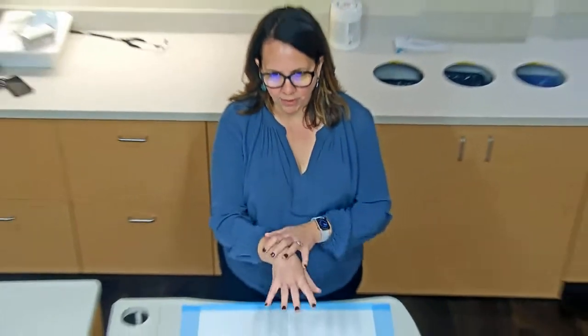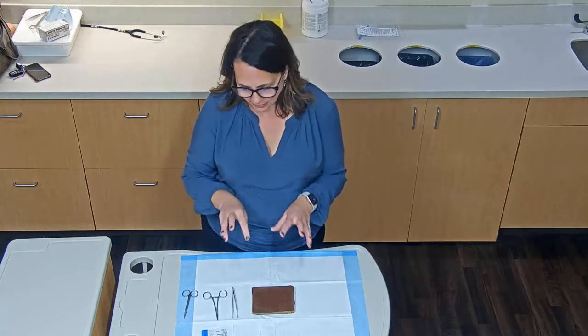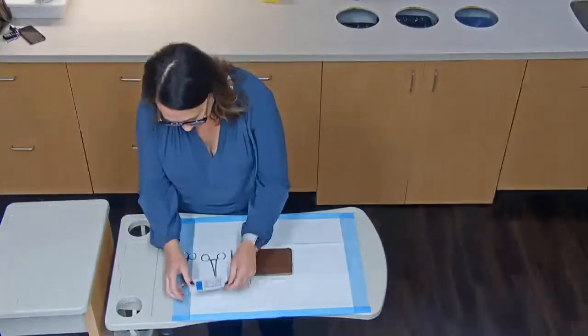Typically, you would do all of your hand hygiene, you'd be wearing gloves, we would anesthetize the area with lidocaine. For today though, so that you can see a little bit better, I won't be wearing gloves, and we're not going to really talk about the lidocaine. Today our focus is really on the suturing.